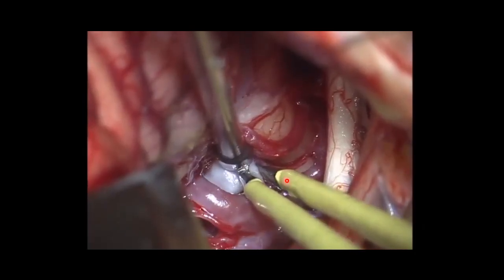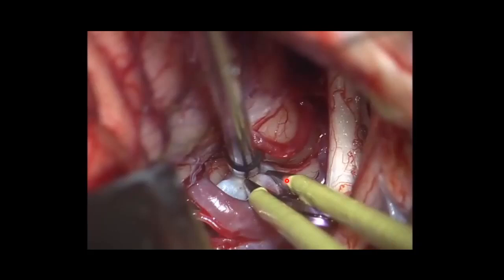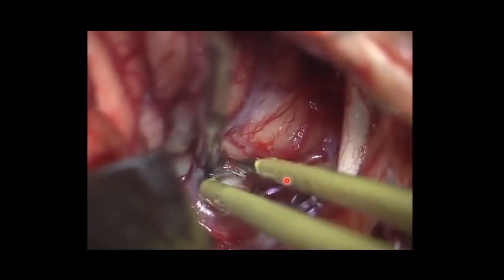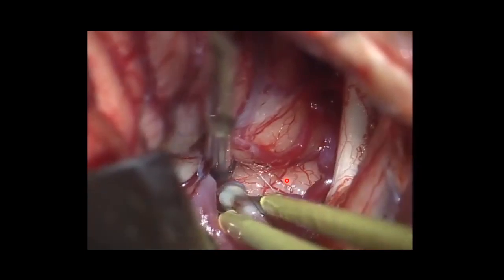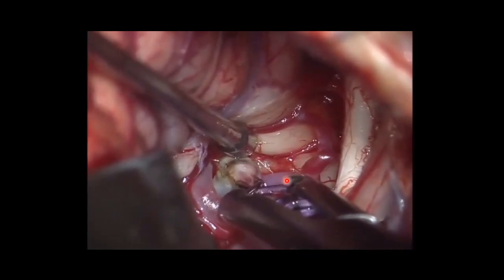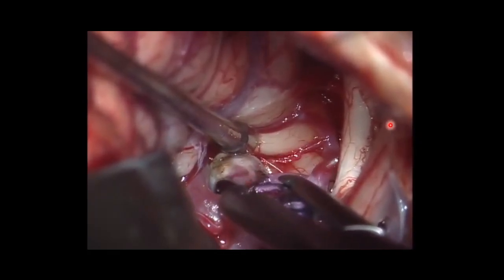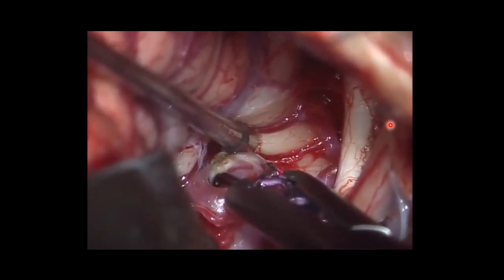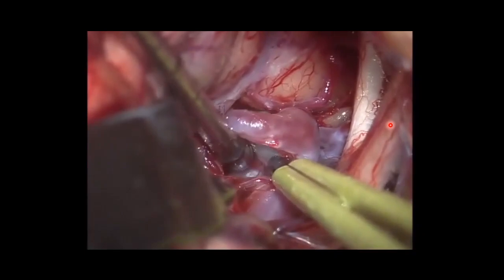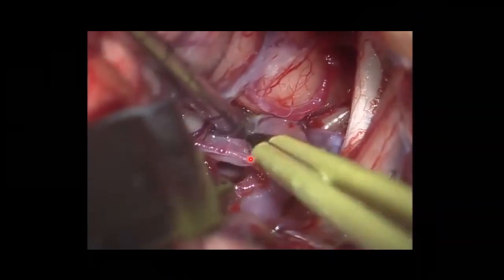Now he's coagulating to shrink the aneurysm. So very gentle coagulation. You cannot squeeze the aneurysm too strongly. Gently squeeze the aneurysm. And then he's releasing the clip. It's not bleeding anymore. So he's going to get another view of the neck of the aneurysm here. You can see this is left A2, right A2.